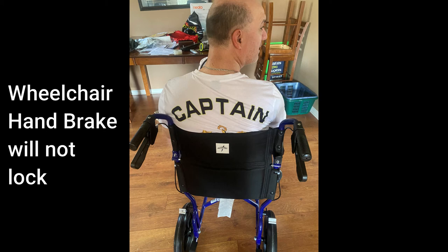This is a typical wheelchair that has a locking handbrake so that people can get in and out without the wheels rolling around. It is also found on walkers. This video is about the problem of the brake not locking.